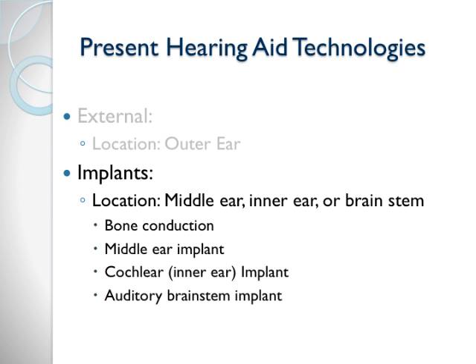Outer ear hearing aids are front-end solutions that act as amplifiers, but can only help in limited situations. Sometimes the ear canal is too obstructed, or the eardrum is dysfunctional due to a birth defect or disease, and we would like to bypass this dysfunctional part of the ear.